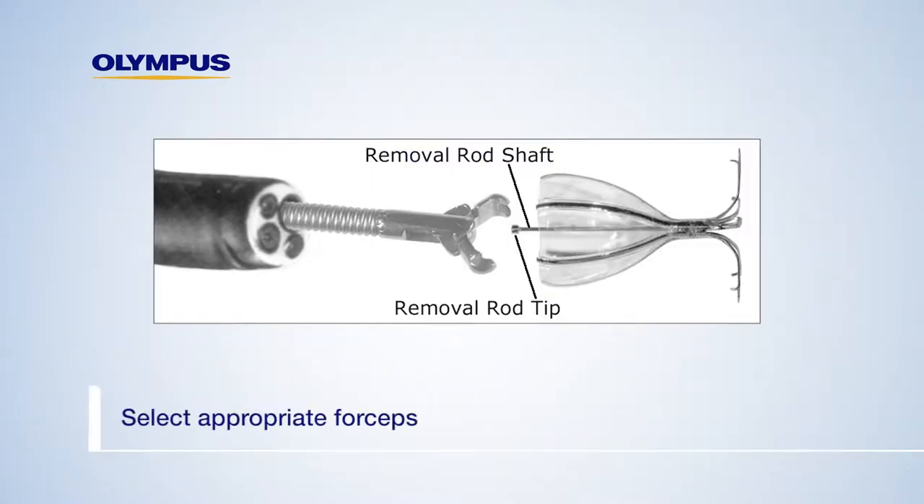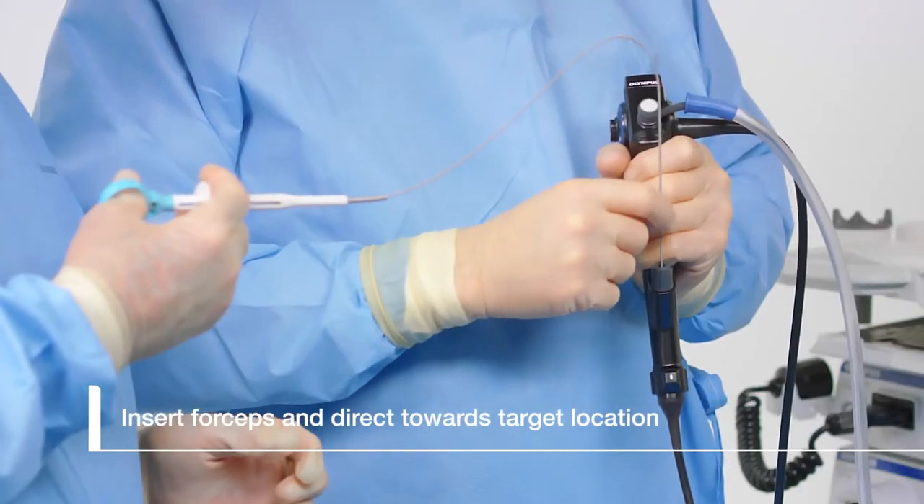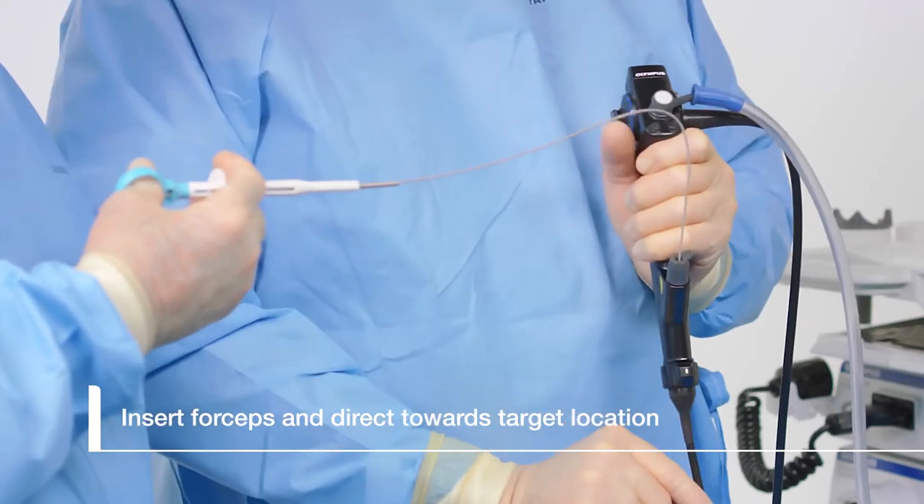Select the appropriate forceps for removing the valve. Insert the forceps through the instrument channel of the bronchoscope, directing the forceps to the target location.